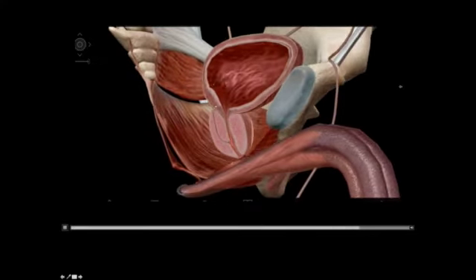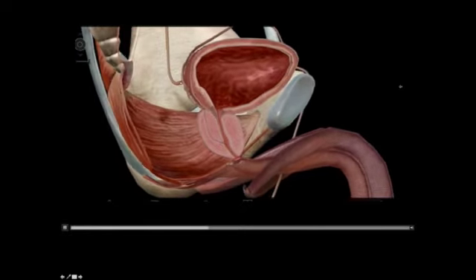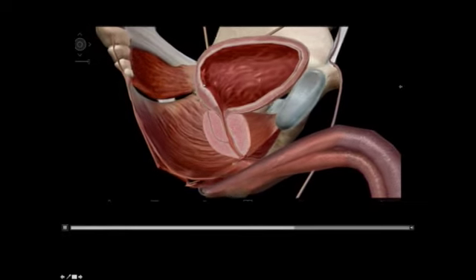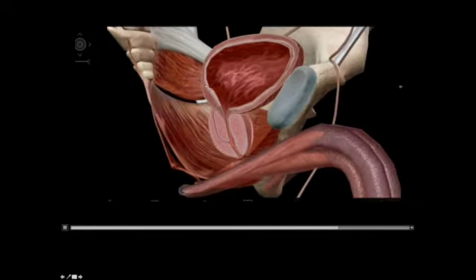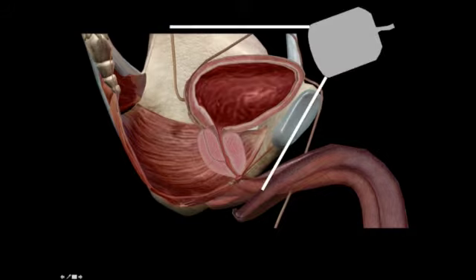You can also explore the prostate and the bladder from top to bottom. So here again is that distal VUJ, which you can follow from about here down and into the ureter, particularly if it's dilated. So here it is in cross section, the male bladder, and you're going to put the probe on anteriorly here to see if you can get your view.